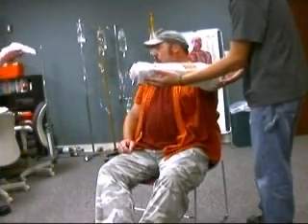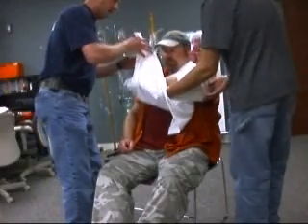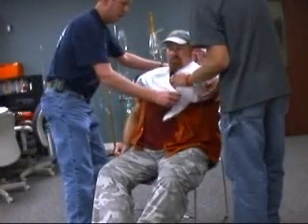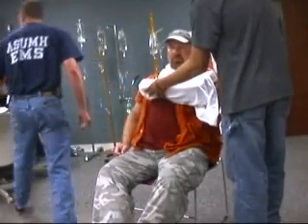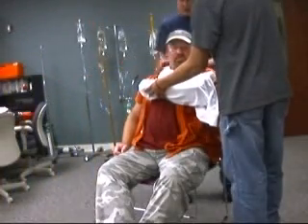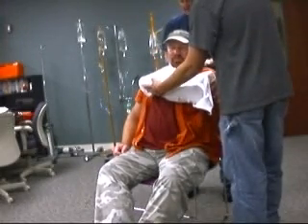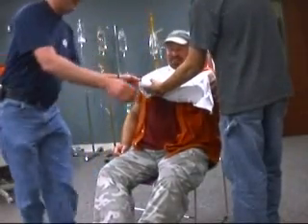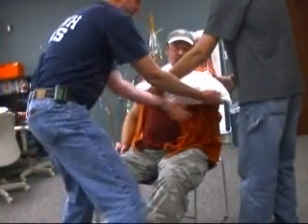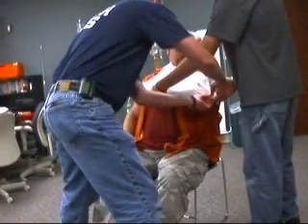I'm going to apply a sling. We're going to place the limb up against the patient's chest, keeping it immobilized. We're going to place padding behind the neck where I'm going to tie the sling. Tying a knot to take care of the excess room in the sling.